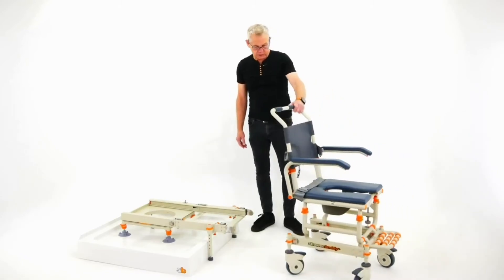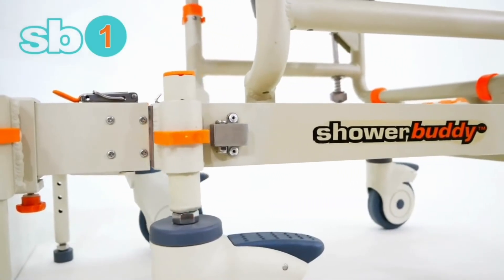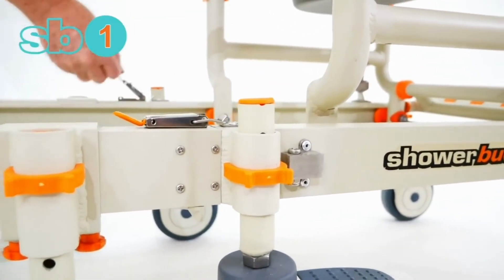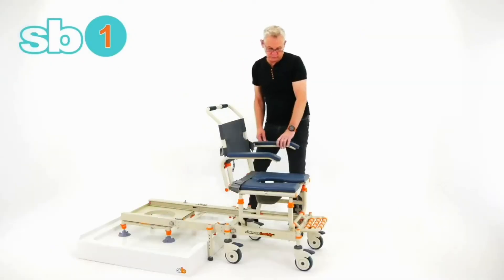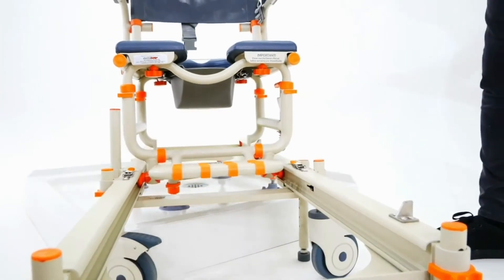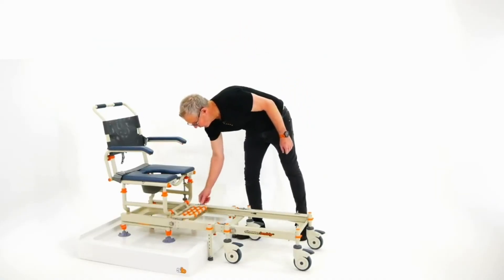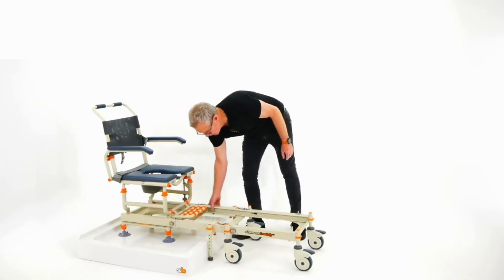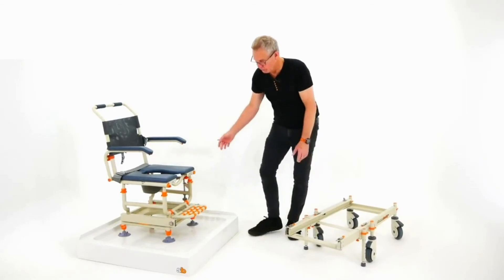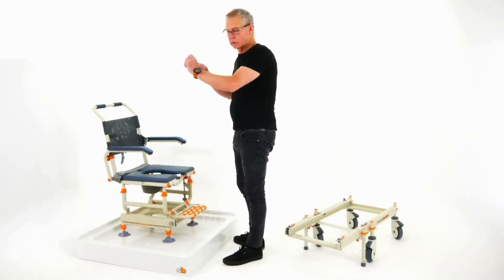Then of course we bring our user up, and just slide the rolling base chair onto the bridge and latch the latches. Your user is ready to be transferred. Release the primary base into the shower, then remove the rolling base unit. Once that's out of the way, your user is in the shower and the door can be closed or the curtain pulled.